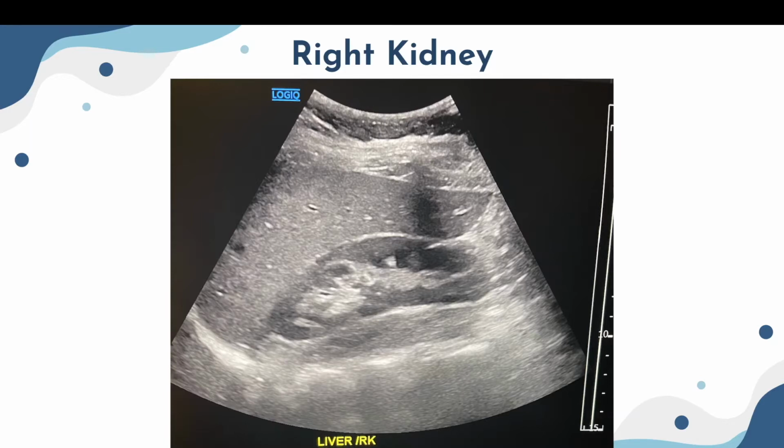Before we had to type stuff, now we have, what is it called, a template. You just pick and choose. We have auto scan where the whole protocol is scanned in, and all you do is push a button and everything just comes up. This is the next image. This is the next image. You don't even have to think about it.